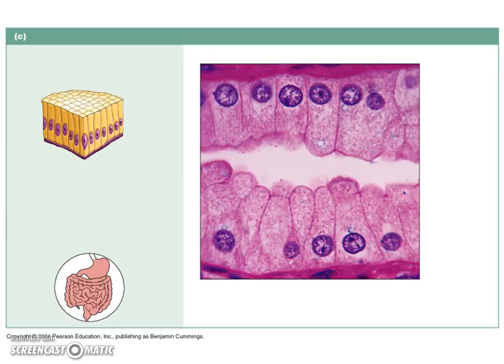Let's go back to the second one, simple columnar. A lot of people say these look like teeth and the mouth in between. These are actually two different layers of simple columnar cells. One layer of taller than wide cells, simple columnar.